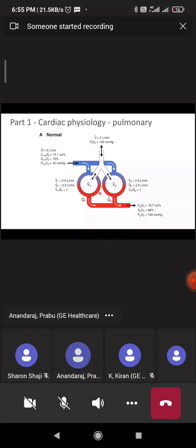So why are you not doing the same thing for neonatal patients? The reason would be, as you know, that flow and the radius of the tube are related to the fourth power. The flow is directly proportional to the fourth power of the radius.